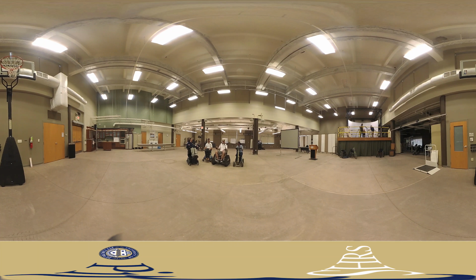This is the BioLab, HERL's main laboratory space. At over 6,300 square feet, there is plenty of room for HERL's research and testing. The space was designed as an open plan for easier cross-consultation among projects and researchers. You're seeing HERL researchers use the HERL-developed new chair and new scooter power wheelchair devices that run solely on compressed air. HERL is also assisting in the testing of the track chair, a rugged wheelchair meant for outdoor use.